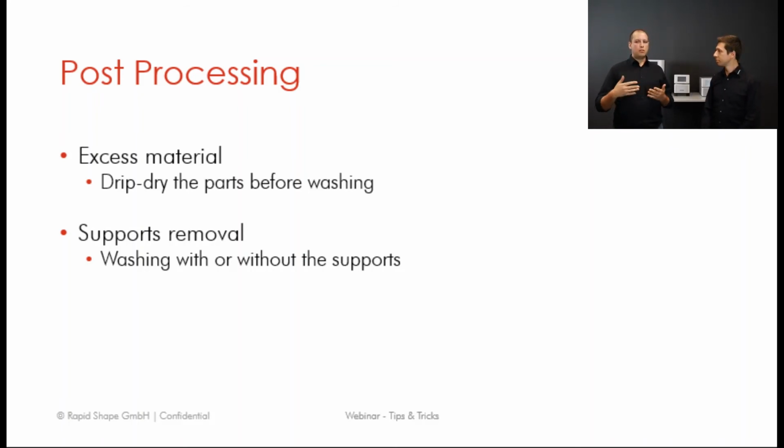When we look at the part that has just finished printing, it's coming out of the resin, so there's lots of liquid resin still on this part. If you leave the model in the printer after it's printed for roughly 10 minutes, all the excess resin should drain off. This is dependent on the design of these models. We understand that sometimes you have models that are hollow, which actually hold some liquid resin internally.